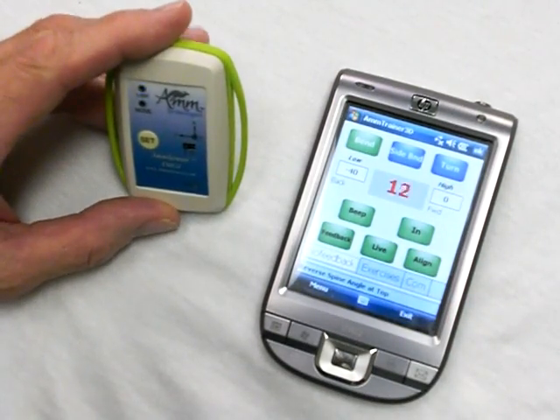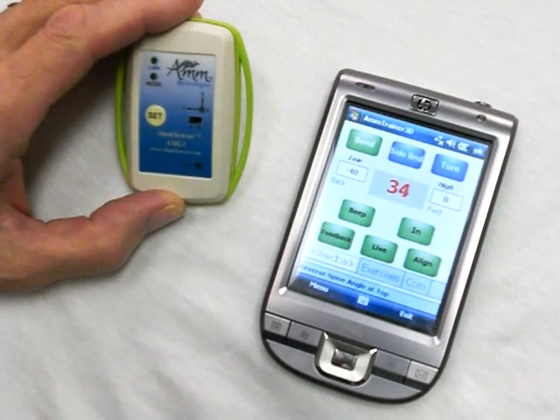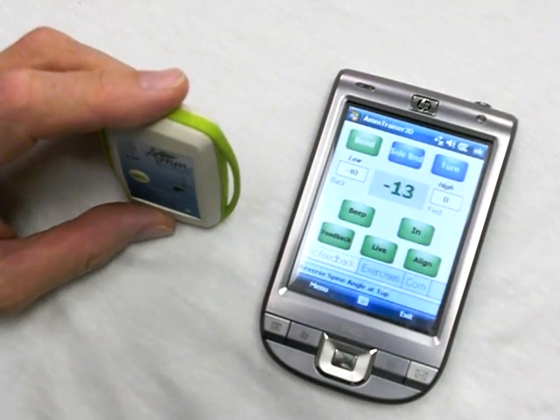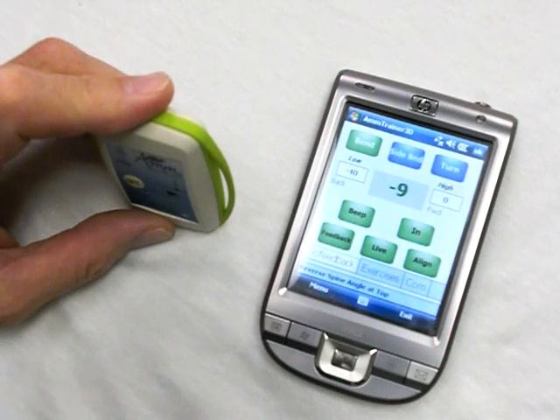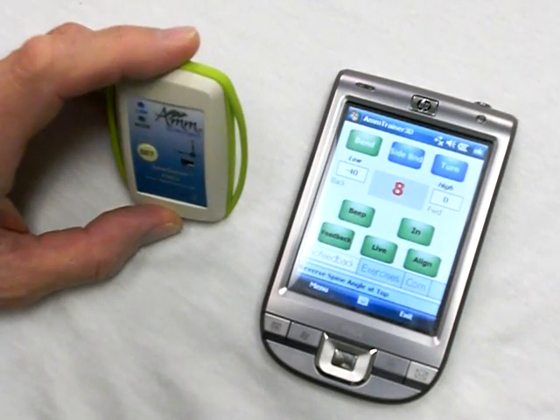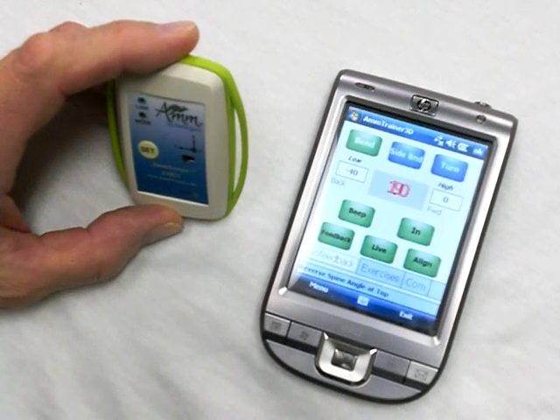Click zero. Now as I bend forward, you can see that I've got about 35 degrees. And then if I straighten up, when I get to zero, I hear the tone. So this is a great biofeedback tone for giving you awareness of body positions for different exercises.